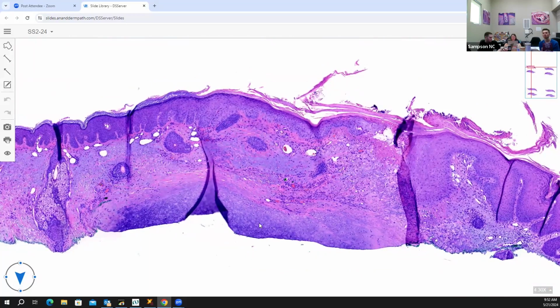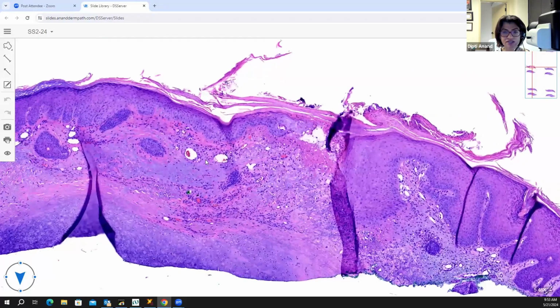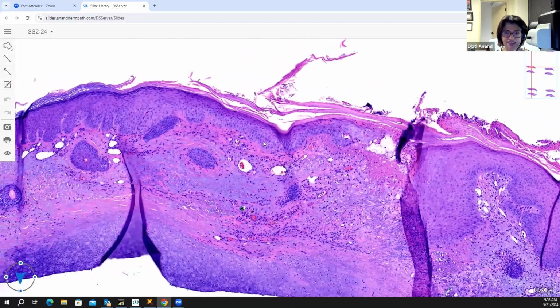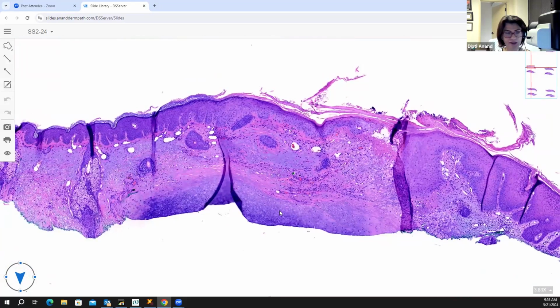So you would think of CNH. Yep, that's exactly what it is. And it's beautiful for CNH, even if it didn't have the cartilage. These changes are very classic, where there is dermal fibrosis, often mixed with solar elastosis, and then you can see the nice telangiectatic vessels. There is hyperplasia, as well as there can be erosion and ulceration. But here you do see the cartilage, which is a very nice clue for CNH. Good?